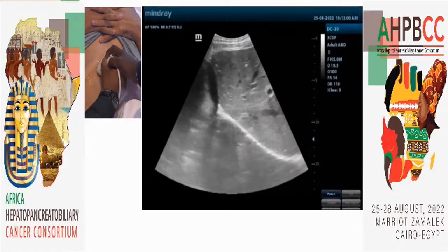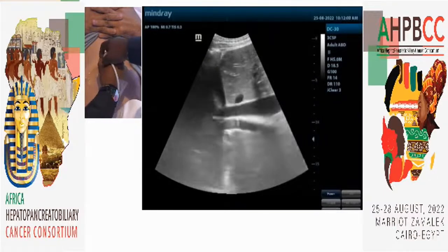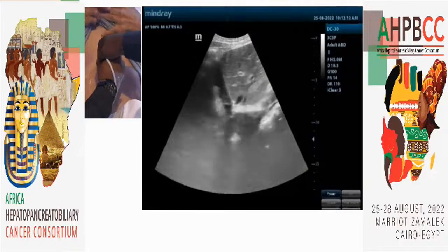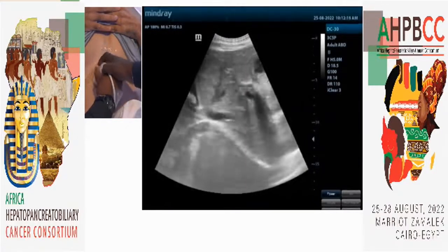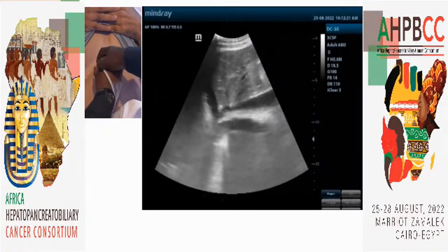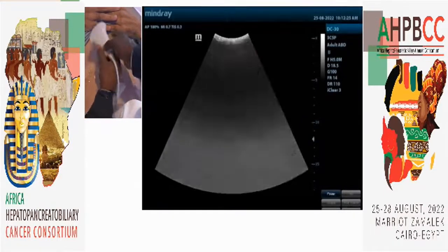Okay. Here the heart. Yes, beautiful. I think you've got it. Yes. Have you? Okay, good. By the way, this is a difficult case.